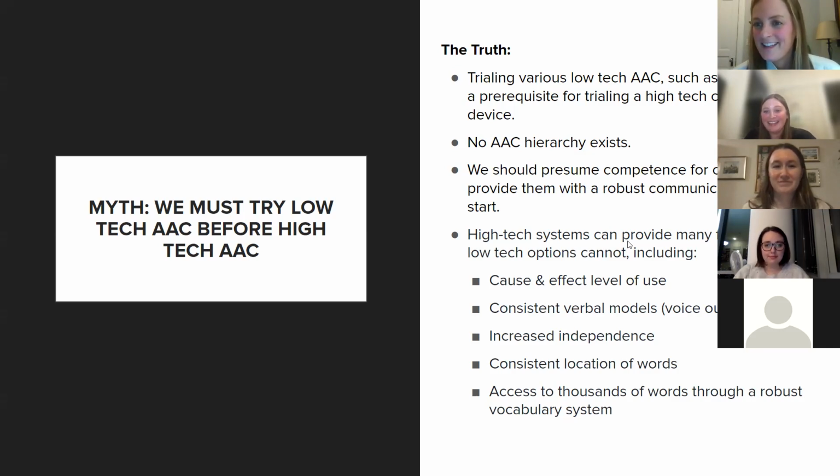Yeah, I would say this is something that we're also learning as well, and learning how to support our Gestalt language processors. For those maybe not so familiar with that term, that is when a kiddo is learning language as chunks of phrases rather than single units. And in an AAC device, usually you're hitting a single unit versus a phrase.